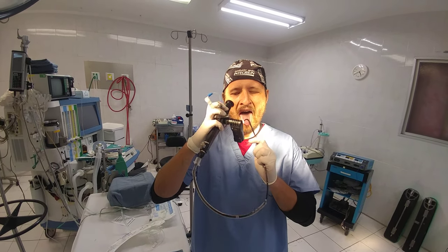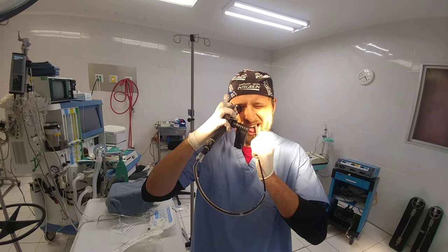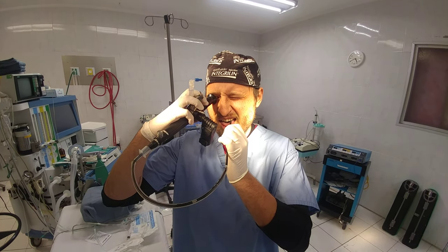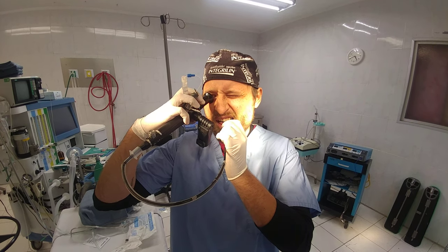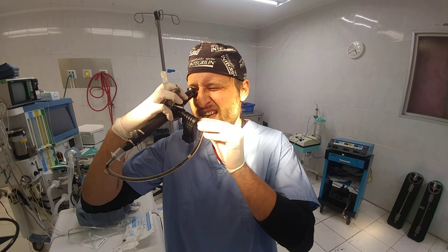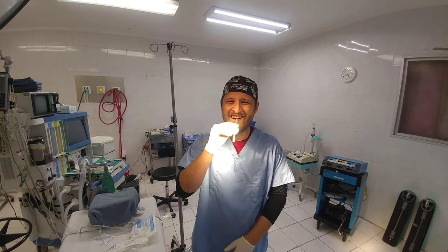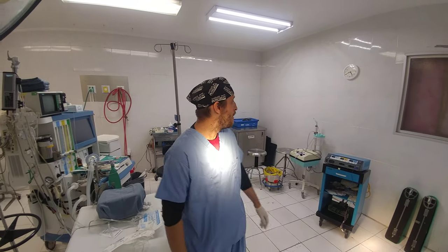Getting my orientation. There we go. Awake intubation — it took about four minutes or so.